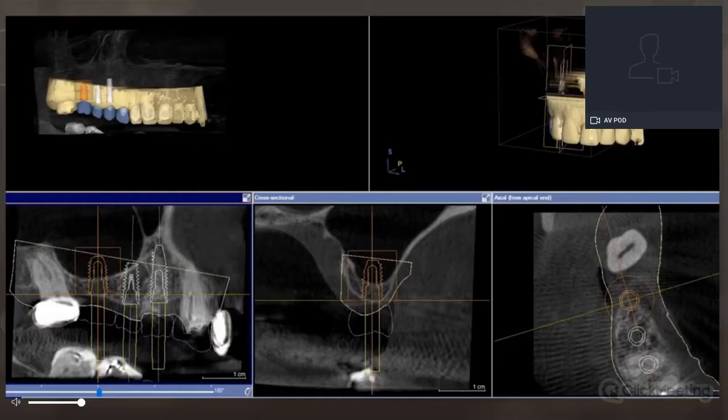But from that digital scan, we've taken a CT scan as well. We've merged the two data sets, and what we see in the top left-hand side here is how the prosthetic envelope is considered for the placement of these implants. Okay, it also helps us to predetermine and assess the degree of sinus grafting we're going to require and whether or not the fractured root is going to pose a problem if we're going to do immediate placements.